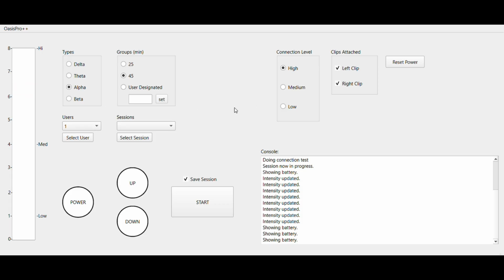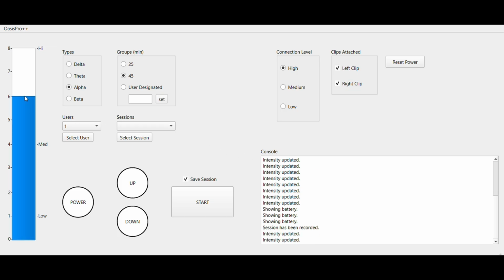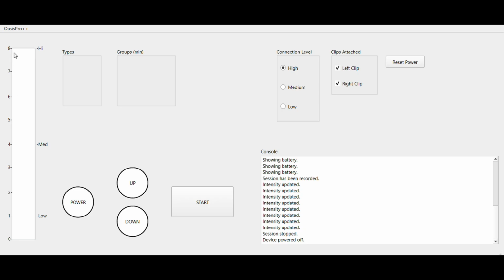So we'll see it's showing the battery, and once the 45 seconds is up, you'll see it soft offs, meaning it just drops the intensity, once every step until it goes to 0. That way it doesn't just go from full intensity to nothing. It'll kind of slowly fade away. You can also see in the console that the session has been recorded.